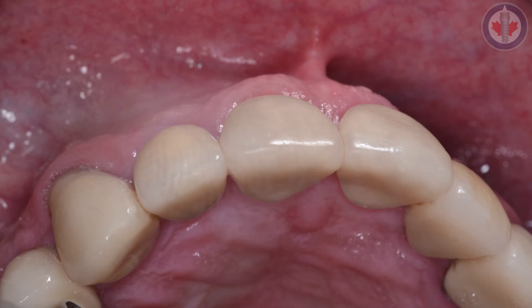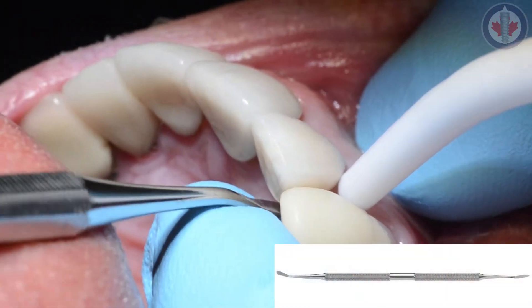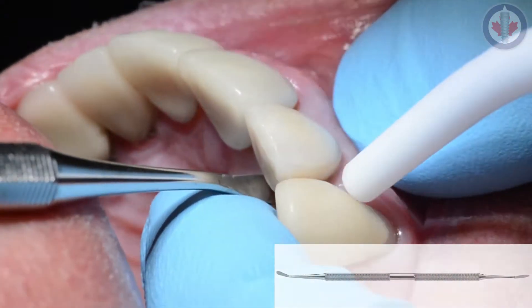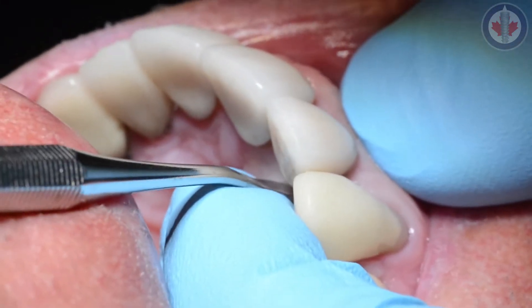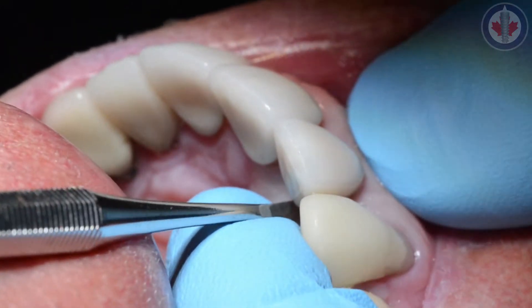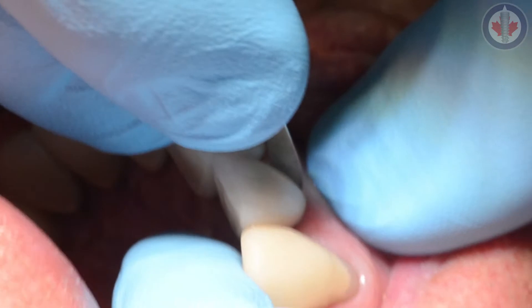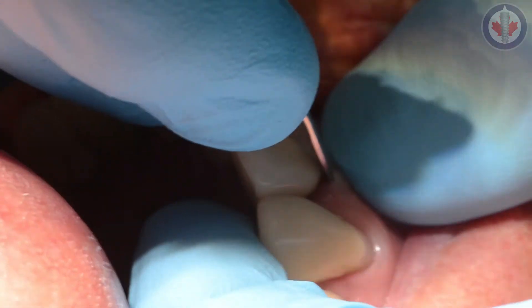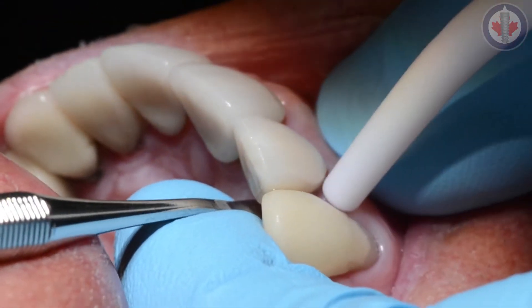Immediate implants present themselves with a number of challenges. Some of the challenges that present with immediate implant dentistry include aesthetic challenges, healing challenges, predicting ridge resorption, temporization, and hard and soft tissue defects.